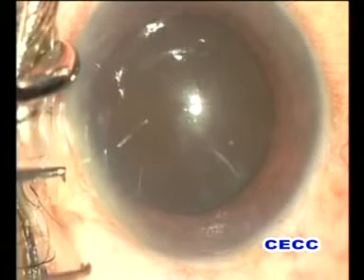This was a 70-year-old male with grade 5 nucleus sclerosis who had a similar problem but was managed differently. This patient had a narrow angle for which a YAG peripheral iridectomy had been performed. Anterior segment biomicroscopy was otherwise unremarkable. A temporal clear corneal phaco with foldable intraocular lens implantation was planned for this gentleman.